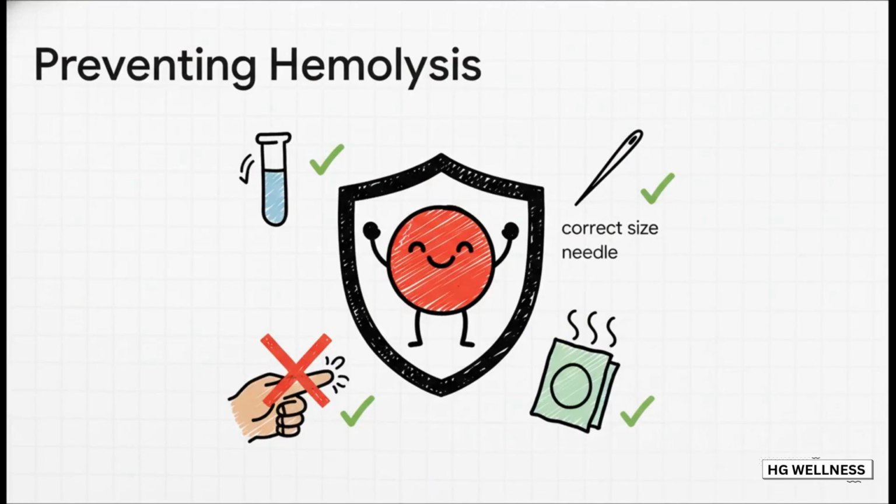We already talked about using the right size needle. Also, make sure that alcohol is completely dry before you make the stick. Don't milk or excessively squeeze a finger during a capillary puncture. And, maybe most importantly, handle those tubes correctly right after the draw.